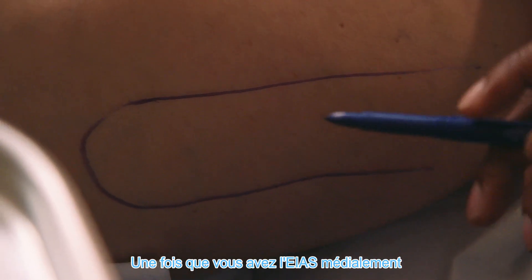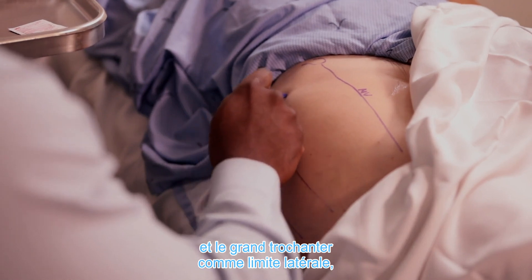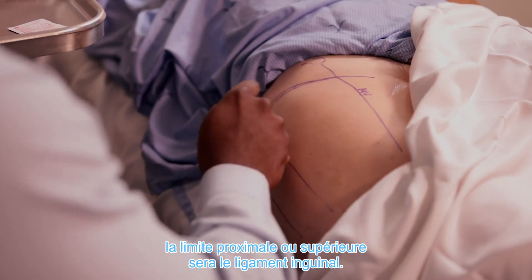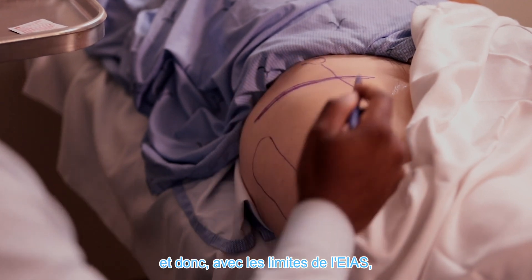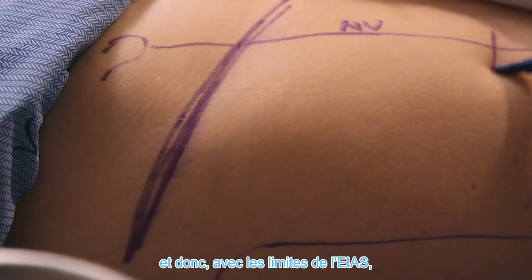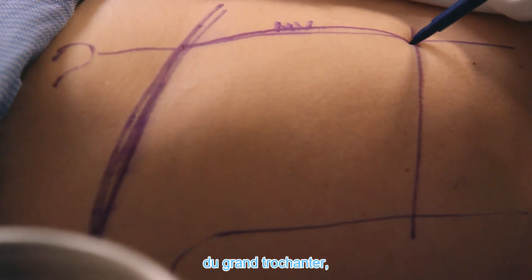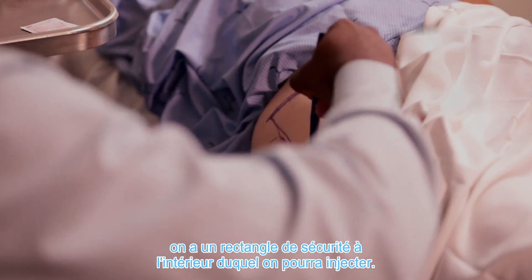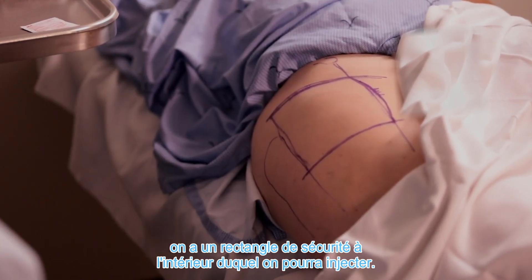Once you have the anterior superior iliac spine marked medially and your lateral border as the greater trochanter, the proximal border or the top of your border will be the inguinal ligament. With the borders of the anterior superior iliac spine, greater trochanter, inguinal ligament, and mid-thigh, you typically have that rectangle of safety that you can inject through.